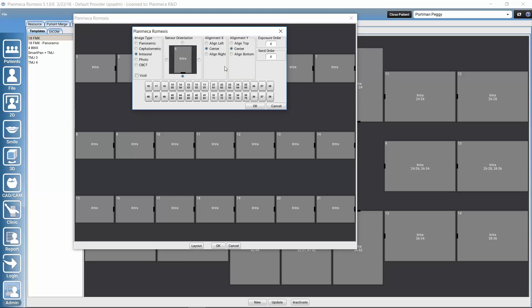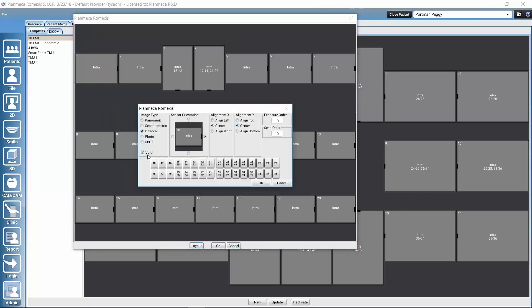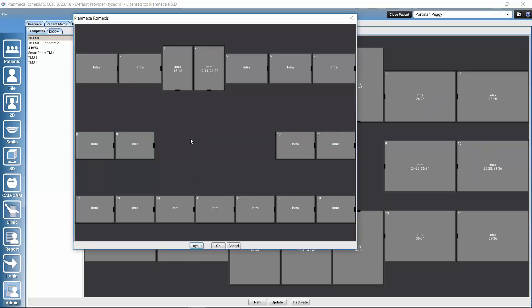When the slot is for an intraoral image, we can define which tooth numbers will be visible. After configuring one slot, we work through the others similarly — changing sensor orientation, defining tooth numbers, and setting exposure order. If a slot should never contain an image, we can double-click it and select 'Void' to remove it from the layout.